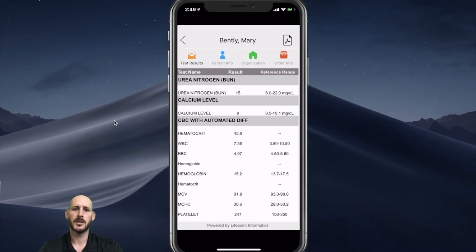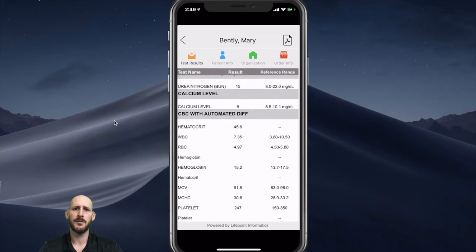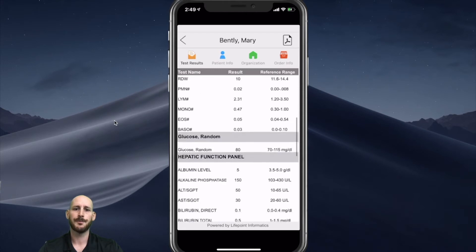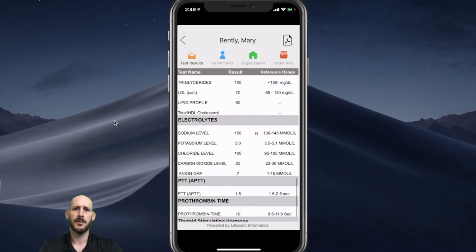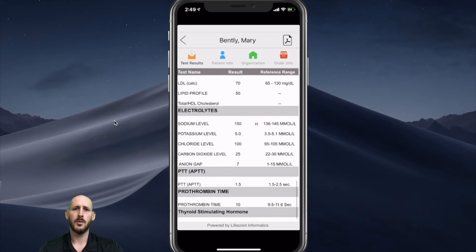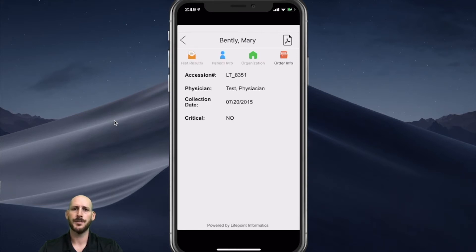The results are listed with the panel names bolded and then any of the analytes listed below. I can scroll down and view any of these results. It will display critical flags or abnormal flags in red. In this case, I have a high sodium value at 150. I can also view additional information here such as patient information or order information.